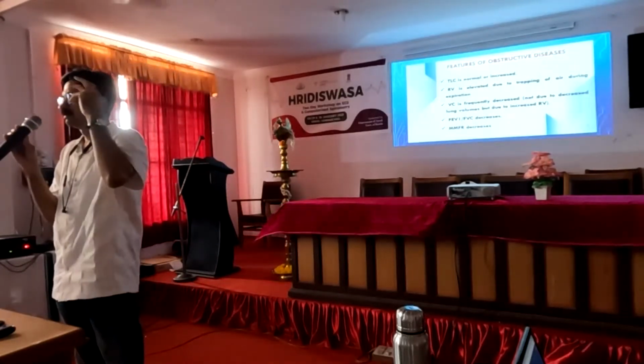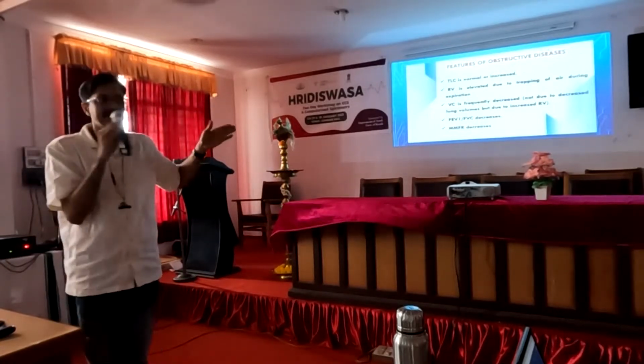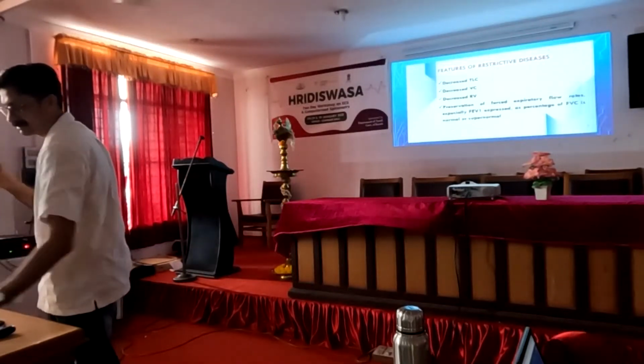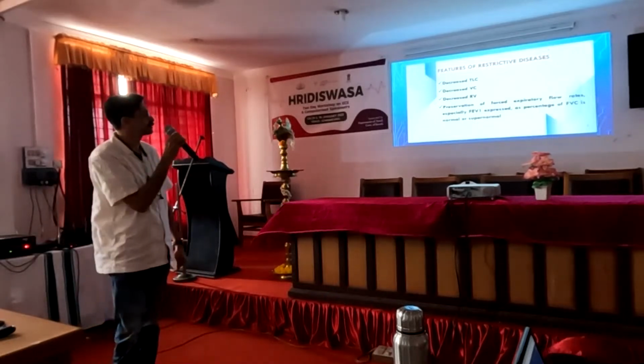As we know, in obstruction, the flow will reduce. So the mid-expiratory maximum flow rate decreases. These all happen in the obstructive diseases. So next is the features of restrictive diseases.